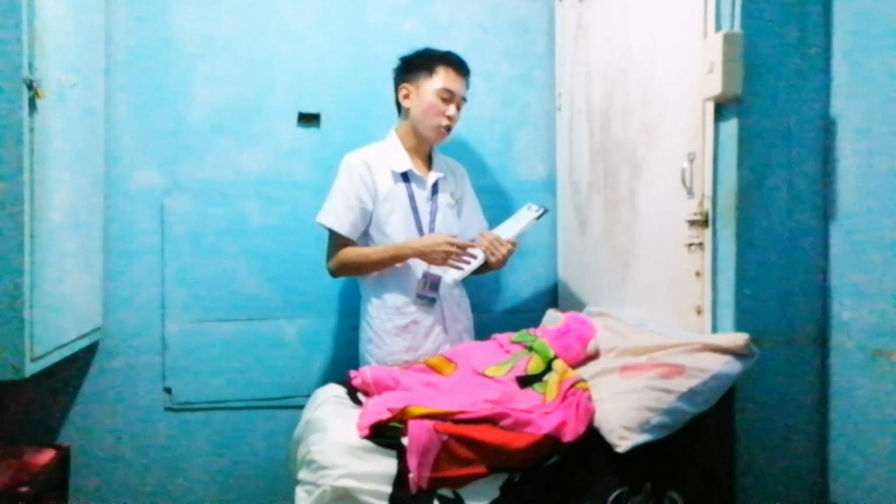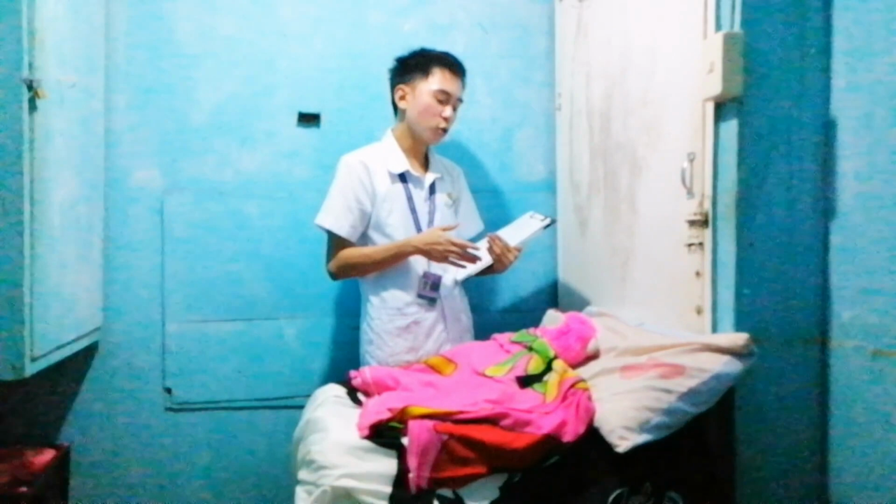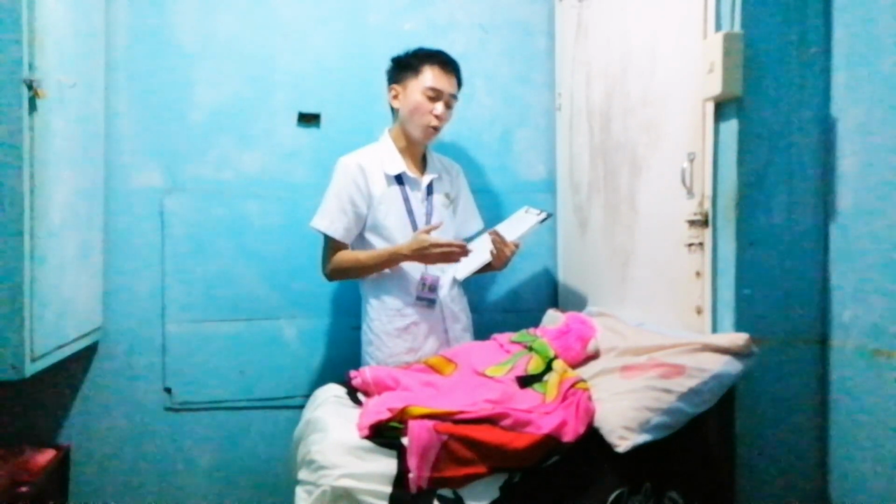Okay, great. So, Ma'am Jenny, the procedure that I'll be doing is administering a subcutaneous medication. This medication will enter your body through the tissue layer between your skin and your muscle. This medication is used for insulin. There are also certain procedures that we need to follow. Is that okay with you, Ma'am Jenny? Any concerns or questions? Okay, great. It is important to explain the procedure to the patient so that they will know how they can participate.